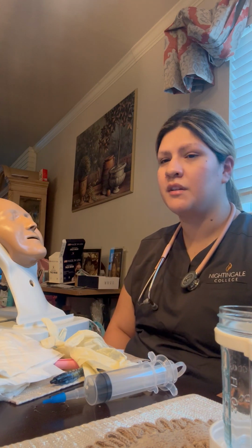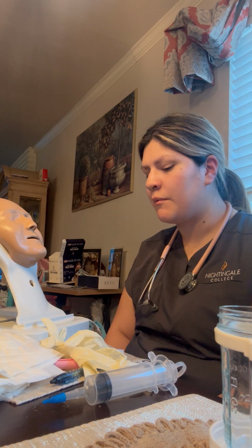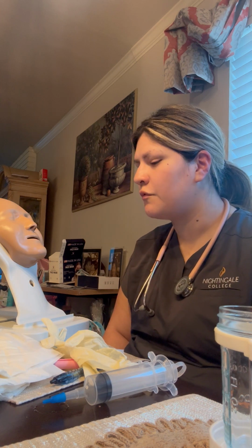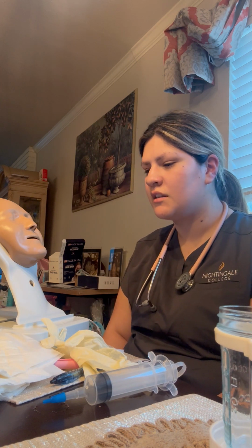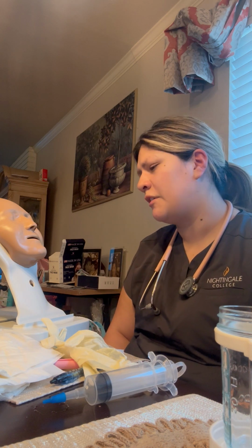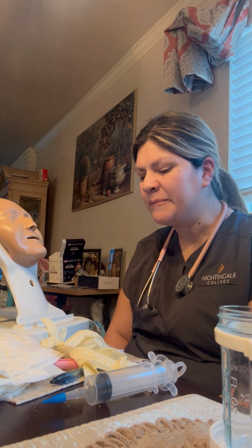So I'm just going to introduce again. Hi, John. So I'm going to be going ahead and inserting the NG tube for you. This is just your doctor put it in to help administer medications to you, okay? Okay.